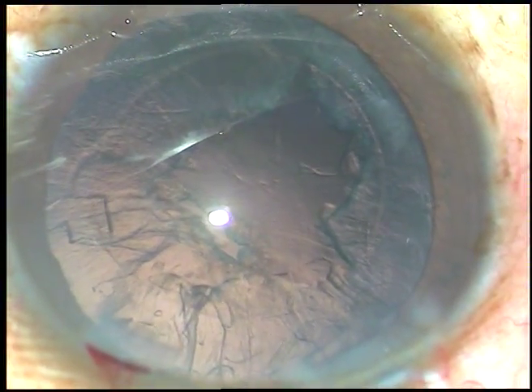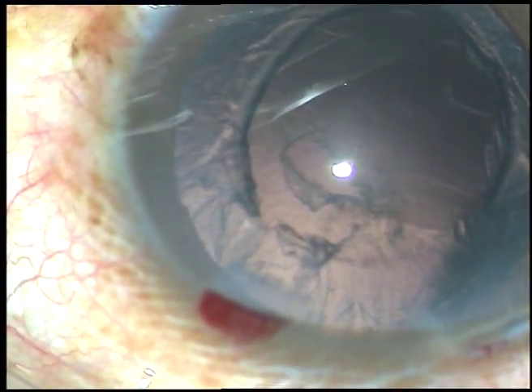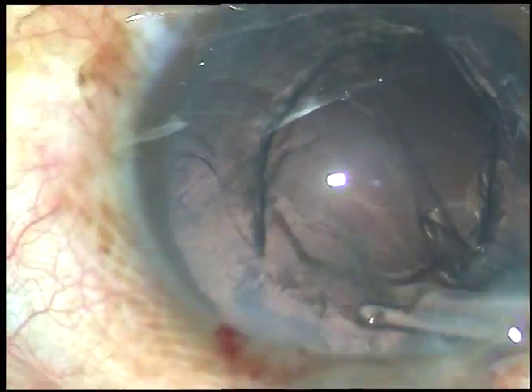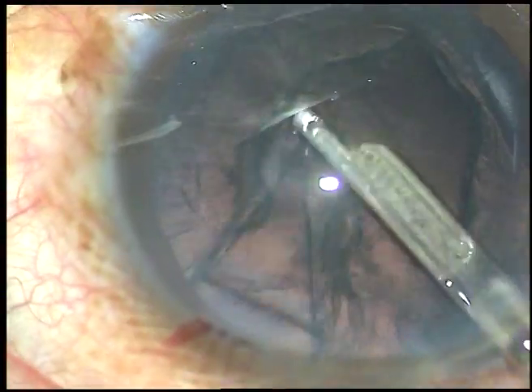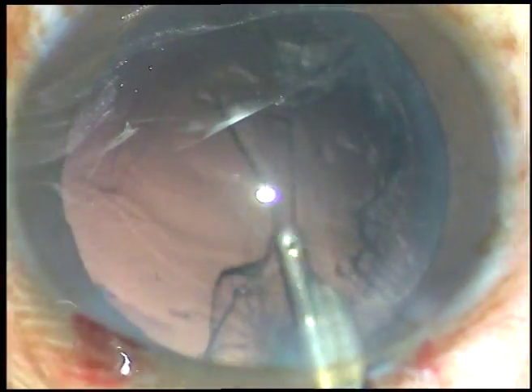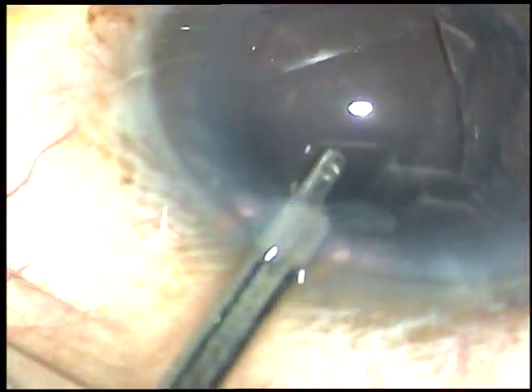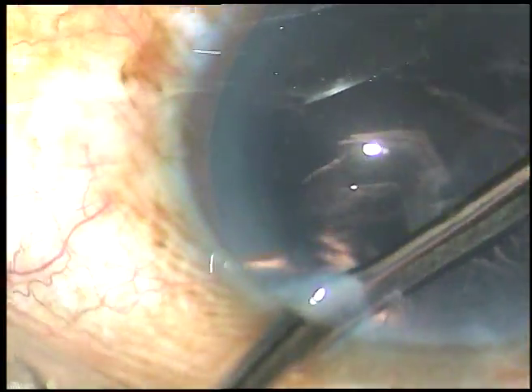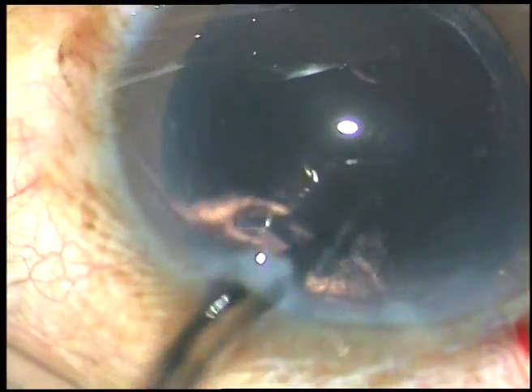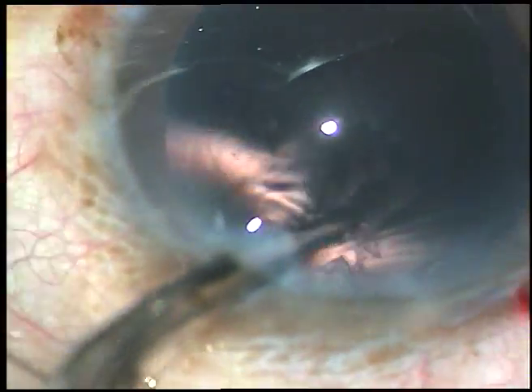Epinucleus has also been removed and now a little bit of viscoelastic substance is injected and the cortex is to be removed. Since there is only one side port, I am using a Simcoe cannula to remove the cortical matter. One can use coaxial I/A to remove the cortical matter. This is a very thin 23-gauge Simcoe cannula and it goes through a 1.4 mm side port very easily.